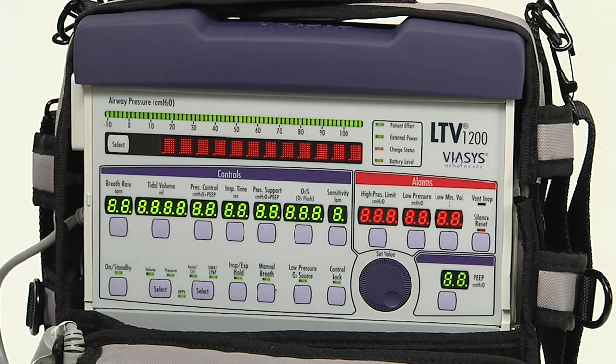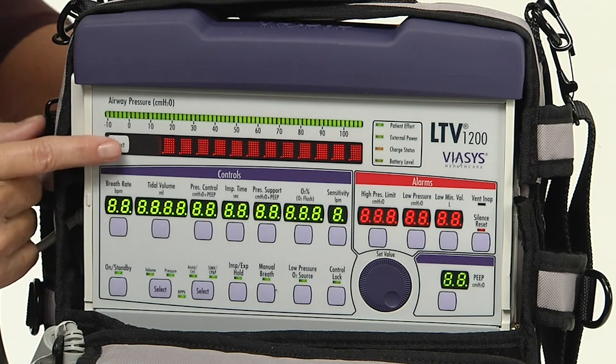Push the select button while the word 'display' is visible. All segments of the seven-segment alphanumeric display will illuminate, all dots of the dot matrix window displays, and all LEDs are illuminated — except the vent in op display. Note: the vent in op LED is tested and verified during the vent in op alarm test later.